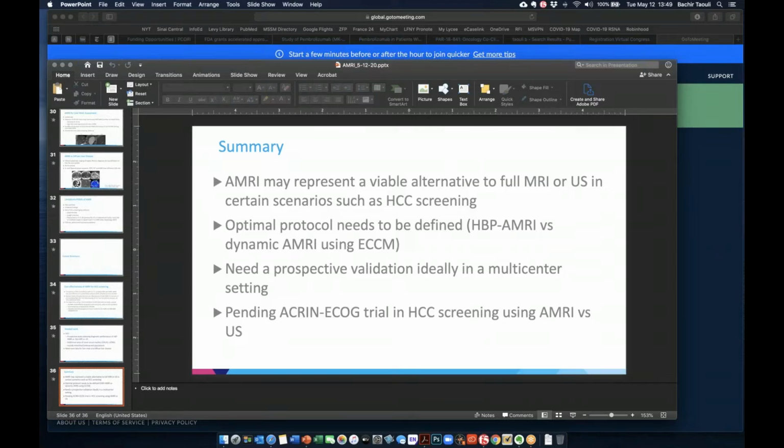I don't think there is any comparison. First of all, there's very little data on contrast enhanced ultrasound in HCC screening. I'm not an expert on CE ultrasound, but I think it is used typically for characterization of nodules that you detect on B-mode ultrasound. So if you see something, you characterize it, but it seems to be more challenging to use it for just screening the whole liver when you inject. You could do it, but I don't think there's a lot of data out there.